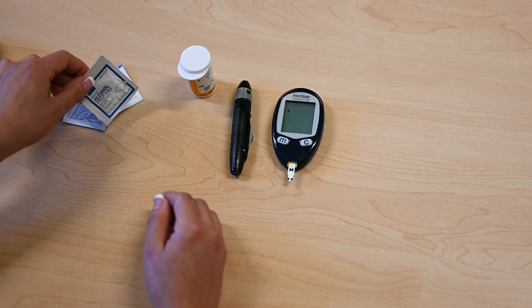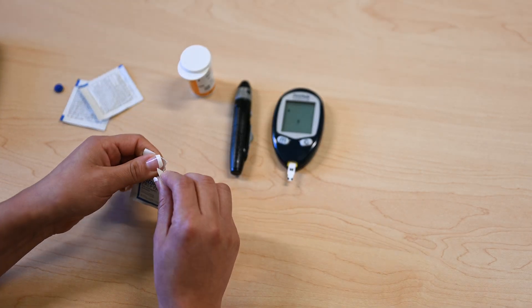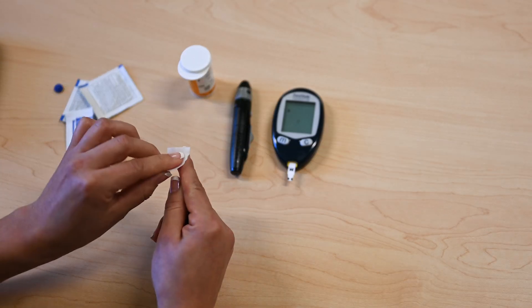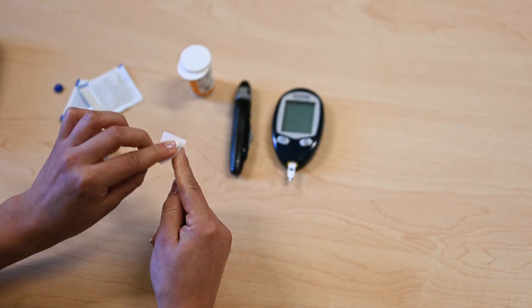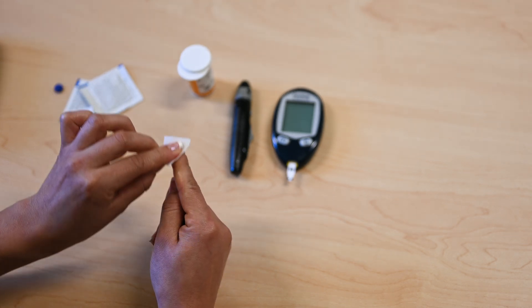Wash your hands with soap and water, or use an alcohol wipe. Allow your finger to dry. The best place to test is on the outside edge of your finger — it hurts less.